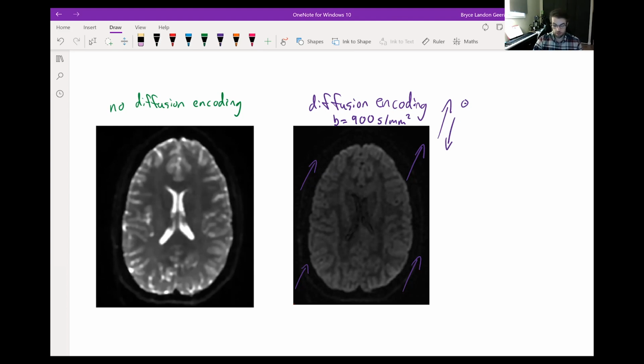The reason that I'm guessing here is because I didn't want to go look up the table of vectors in this 30 volume scan to figure out which one this was. It doesn't particularly matter because we can still, regardless, highlight changes in the image that are going to help us understand what this is actually telling us. So let's look at 3 different regions of our image. First, I want to highlight the ventricles. So this one's bigger, so I'm going to highlight it in blue.